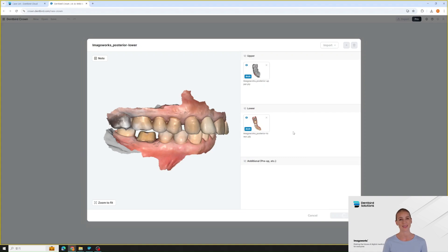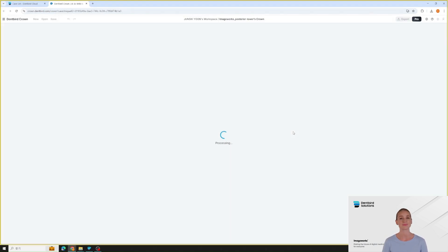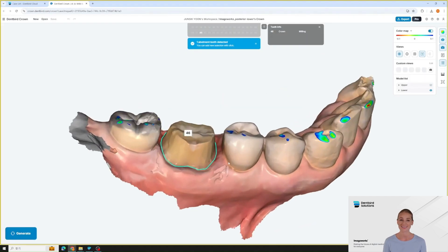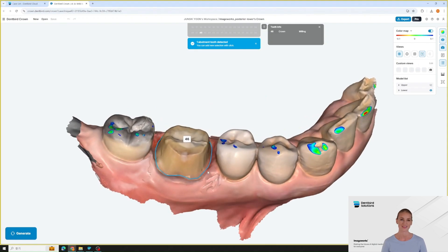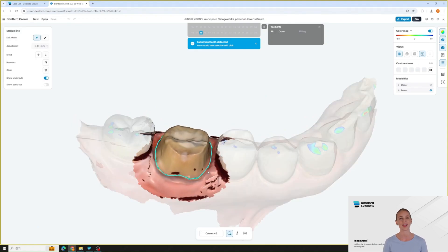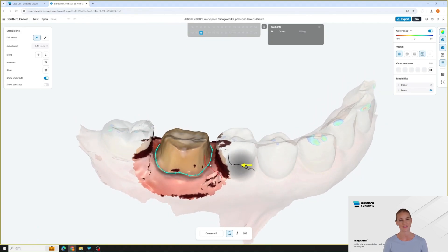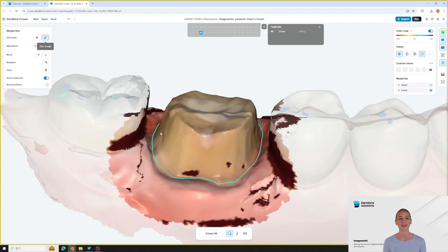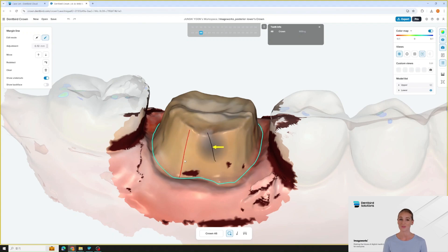Unlike other CAD software, where you have to manually draw the margin, find the right library, and shape the design manually — DentBird AI automatically detects and sets the margins. You can adjust them if needed, but most of the time the AI margins will be perfect. If you want to modify, you can use point mode or pen mode to draw freely, making easy adjustments with our convenient tools.